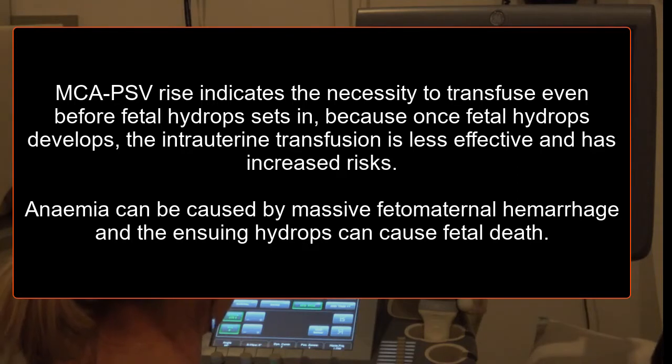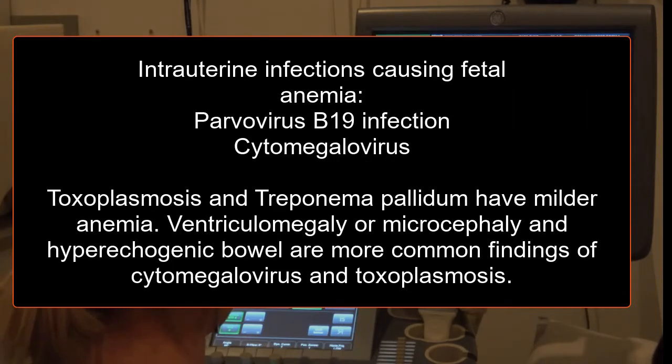Not because the reasons leading to that are rarer, aren't they? It's not auto, allo, rhesus, viral. But the good thing is that our viewpoint software has the chart, so all you've got to do is get what Jasmine just got, look at the chart, and it'll tell you.